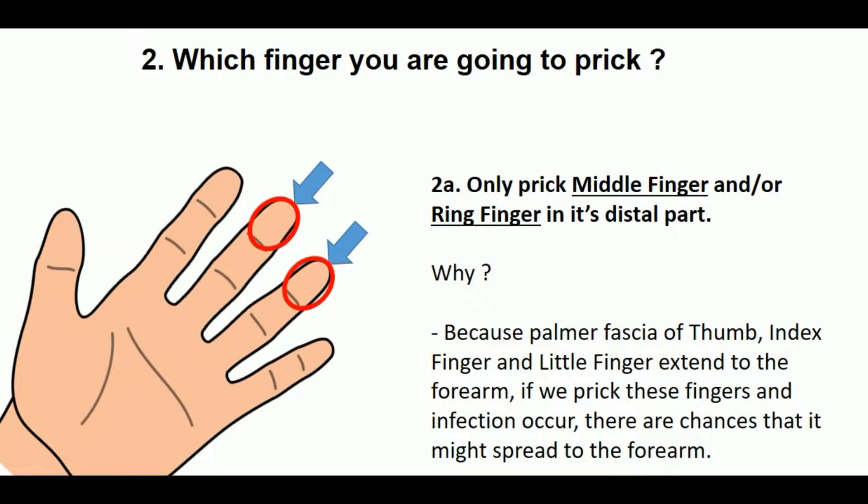Which finger are you going to prick? Only prick the middle finger or ring finger in its distal part, as you are seeing in the photograph. Why? Because the palmar fascia of the thumb, index finger, and little finger extend to the forearm. If we prick these fingers and infection occurs, there are chances it might spread to the forearm.